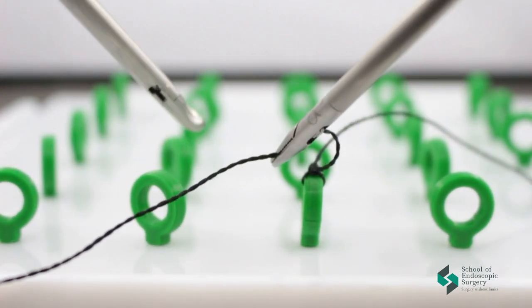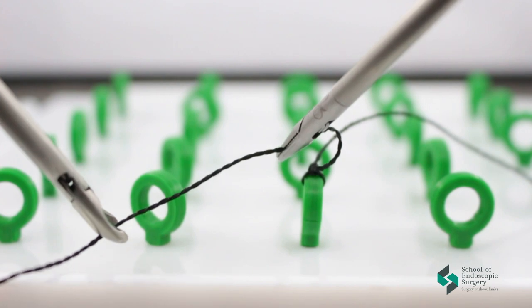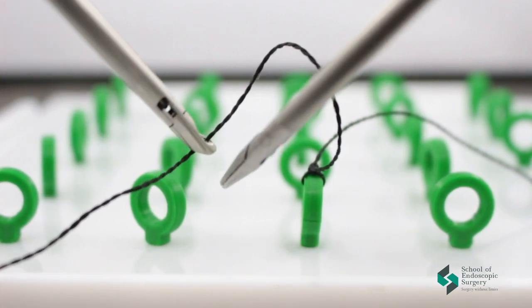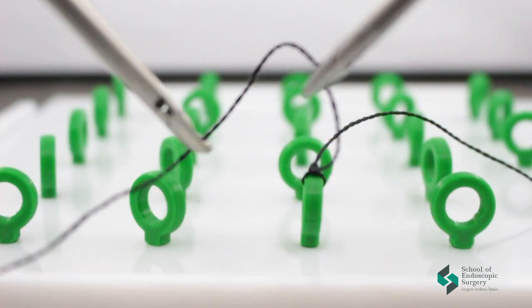It is the formation of a knot with two instruments inside the human body or an endoscopic box in our case. The knot is based on formation of an arc of thread.